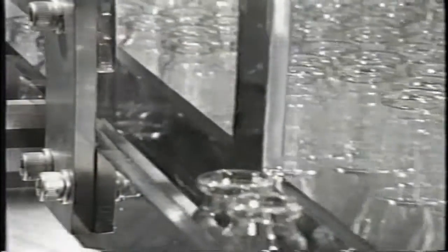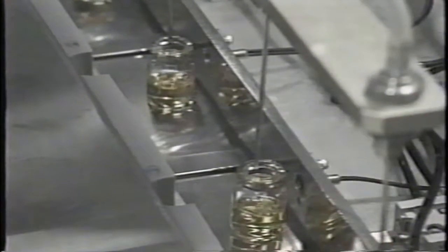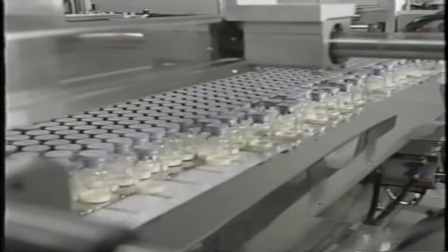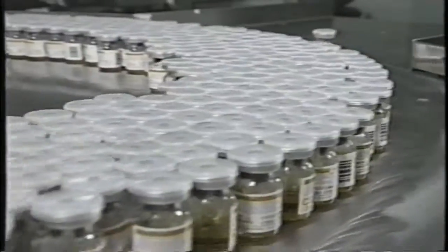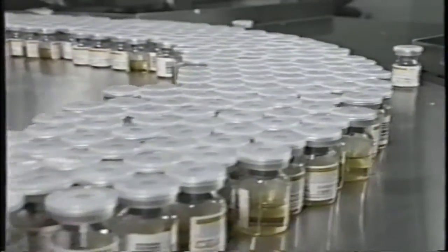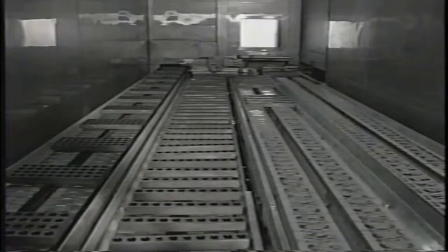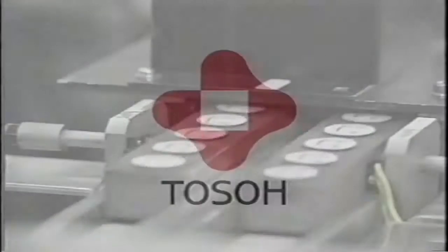The same care goes into the manufacturing of calibrators, controls, diluting solutions, and common reagents for the AIA systems — the same clean environment and the same uncompromising quality control. These painstaking manufacturing and quality control procedures, and TOSO's investment in this state-of-the-art facility, are only a part of our long-term commitment to supporting your immunoassay requirements. As we have seen, TOSO has utilized its highly advanced technology to create an automated production system of unparalleled quality. Already, the TOSO AIA systems are setting new standards in reliability and consistency in our customers' laboratories.